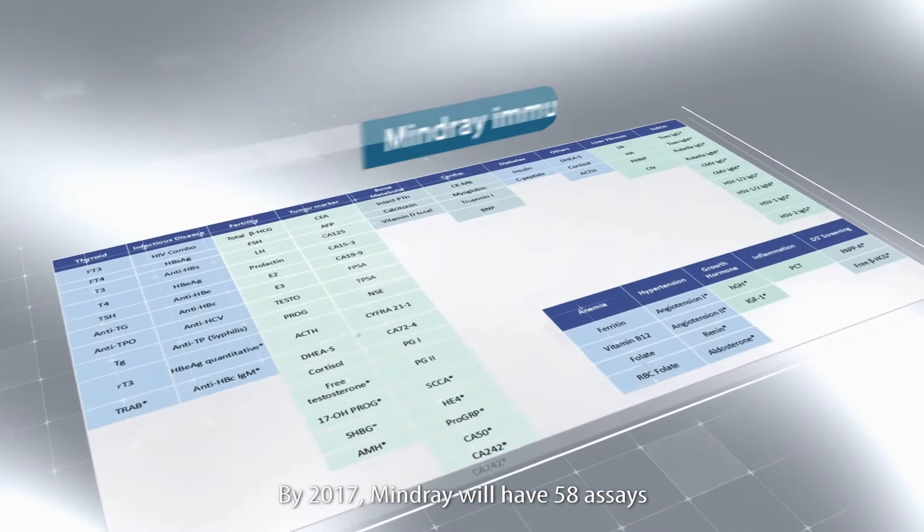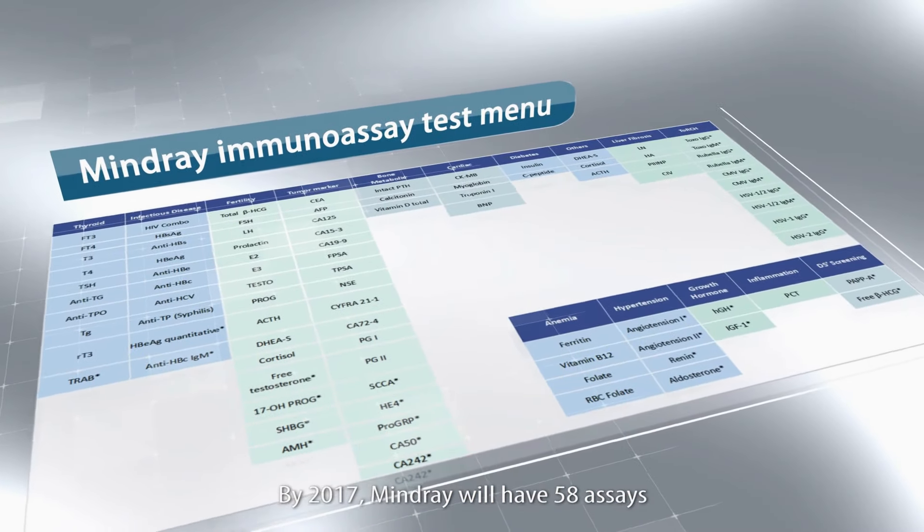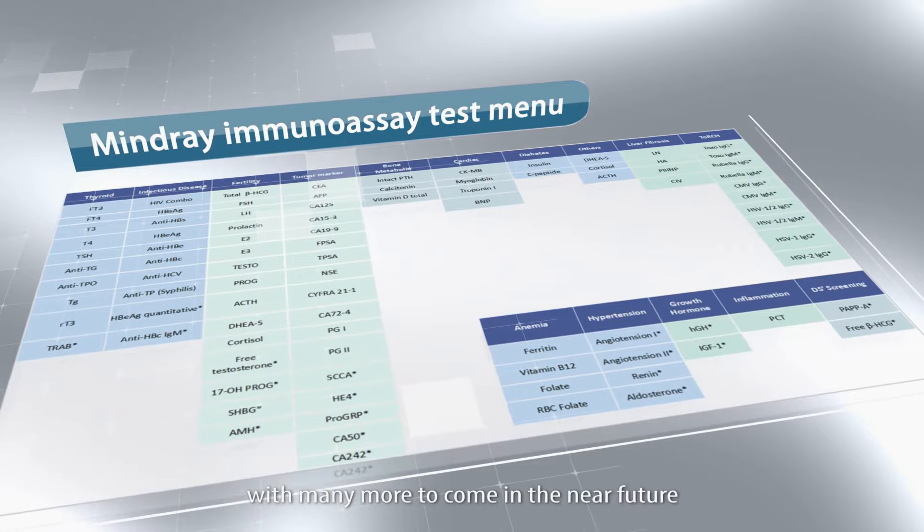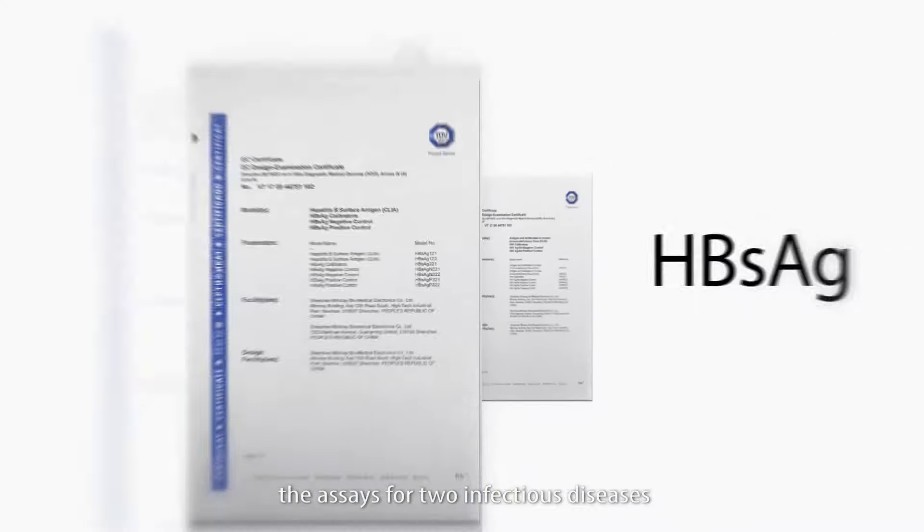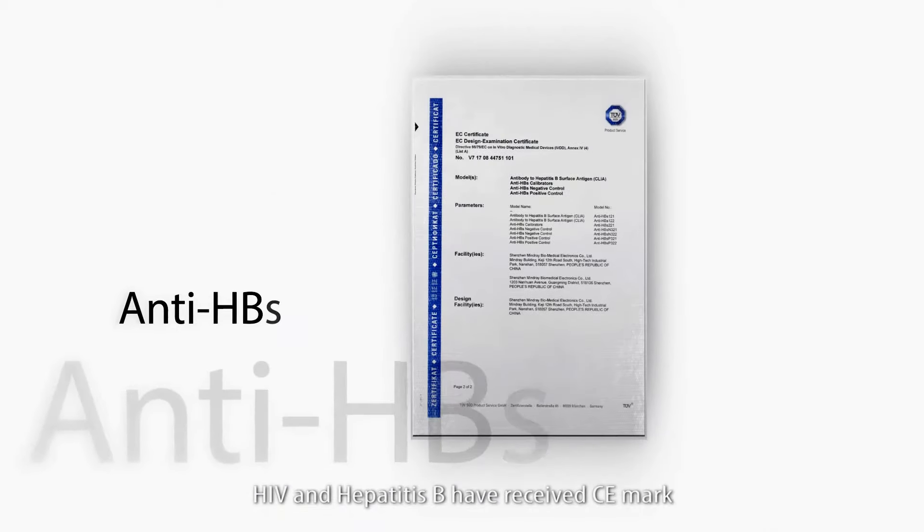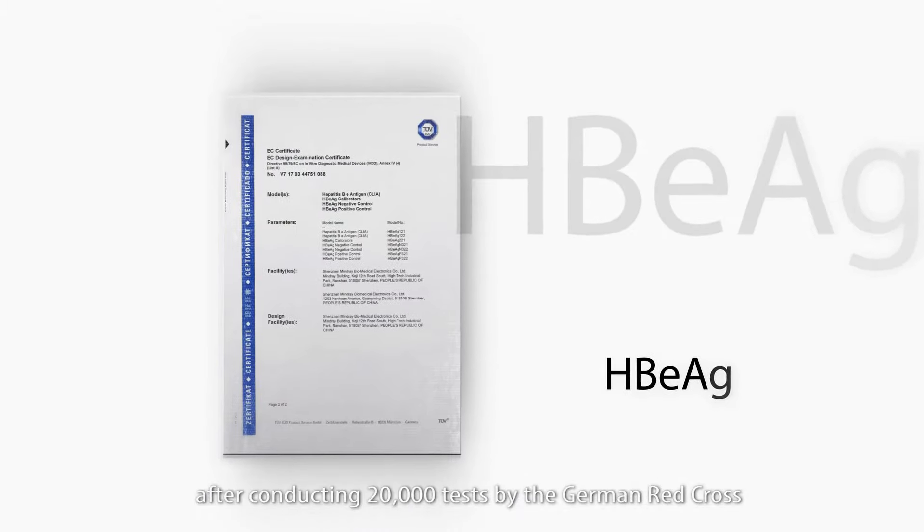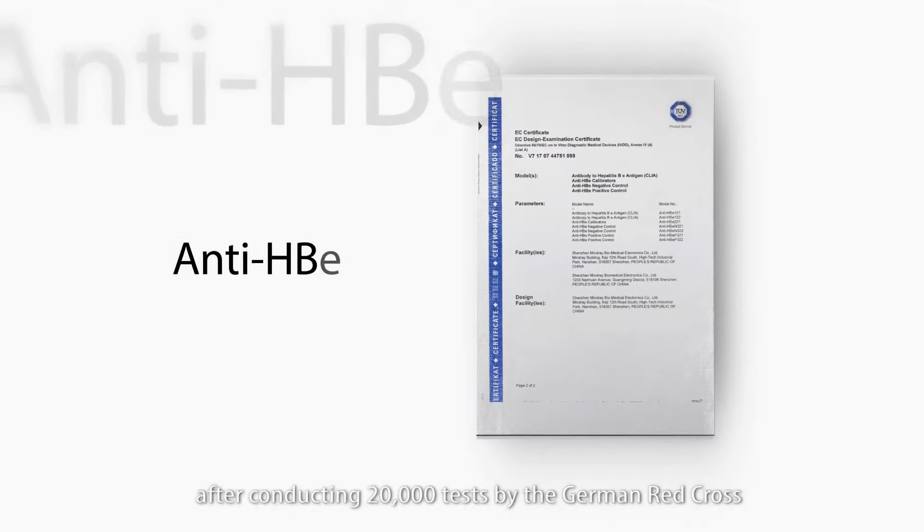By 2017, Mindray will have 58 assays with many more to come in the near future. The assays for two infectious diseases, HIV and Hepatitis B, have received CE mark after conducting 20,000 tests by the German Red Cross.